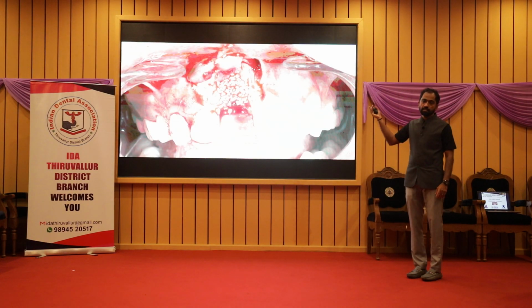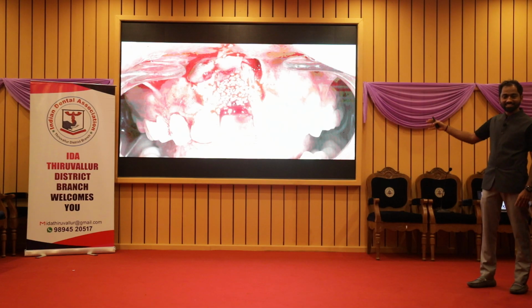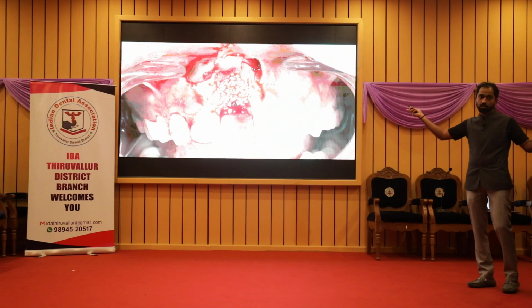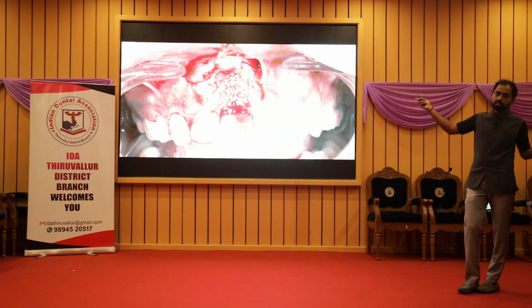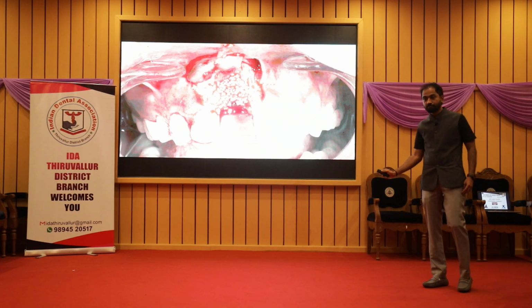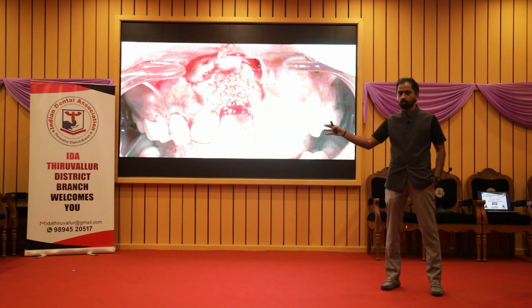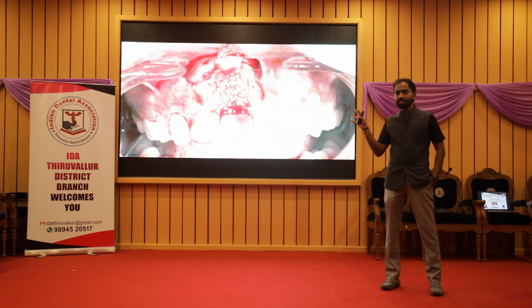I grafted it, placed a membrane, and closed it. I don't know how it will come. Maybe one day when I come, I will present this case after taking the CBCT. This is a xenograft. This is not allograft. This is xenograft, from Nova Bone, not the putty one. And always when you keep a graft, you have to place a membrane, whether it is a normal collagen membrane or you want to keep a PTFE non-resorbable membrane, anything is okay.